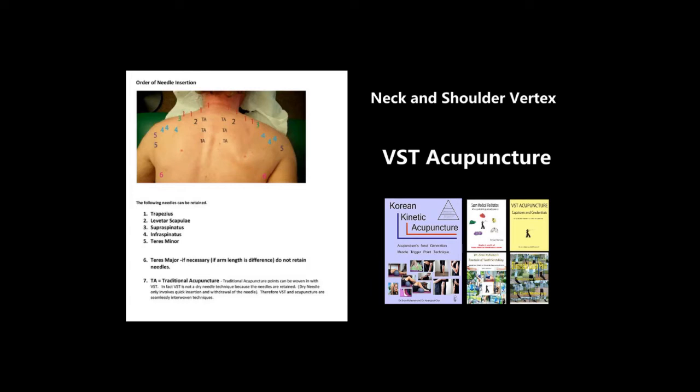With the levator scapula, as with all the rest of the points, you want to rely on your acupuncture needling training in regards to the depth of the needle and the direction of the needle. So, for instance, with the levator scapula, this is number 2. It's located in the upper medial scapula area, and we needle in a perpendicular oblique angle into that upper corner, in the direction of the scapula.